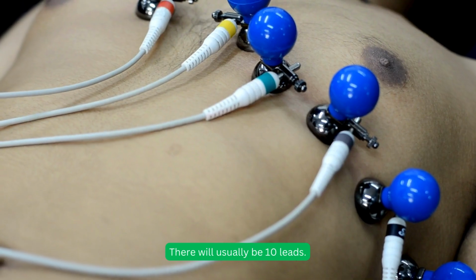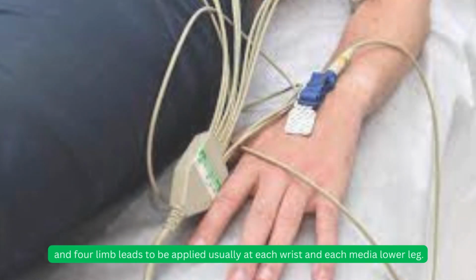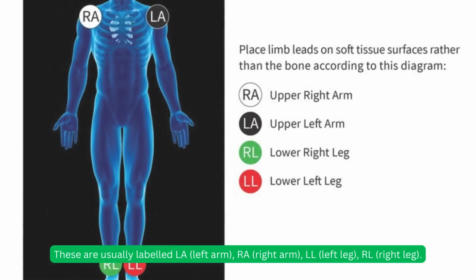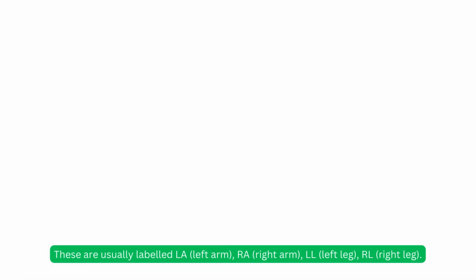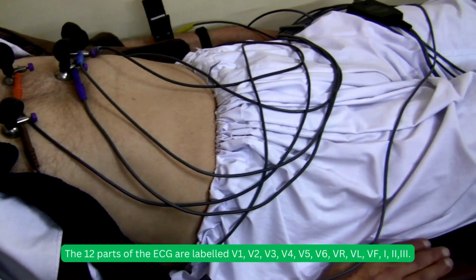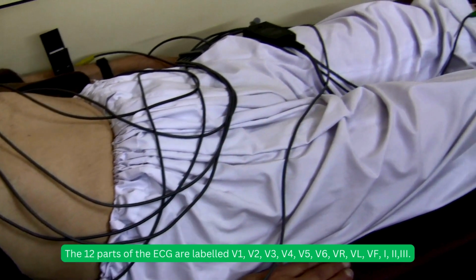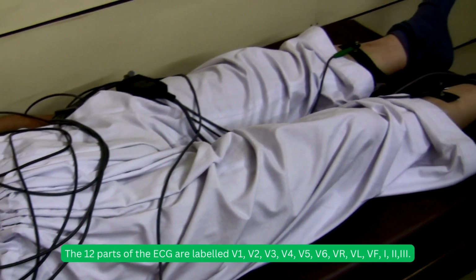There will usually be 10 leads. Leads are named. They are V1, V2, V3, V4, V5, V6 to be applied over the thorax, and forelimb leads to be applied usually at each wrist and each medial lower leg. These are usually labeled LA, left arm, RA, right arm, LL, left leg, RL, right leg. The 12 parts of the ECG are labeled V1, V2, V3, V4, V5, V6, VR, VL, VF, 1, 2, 3.